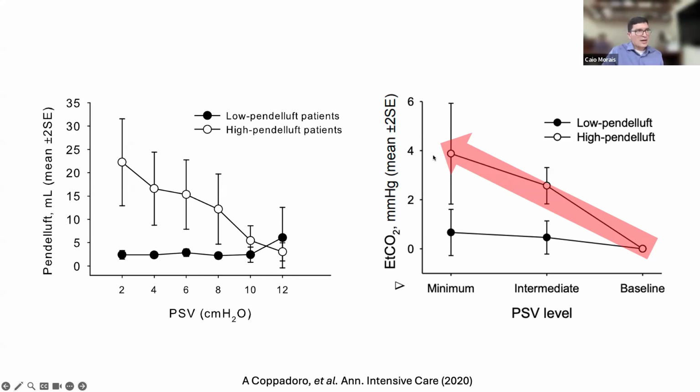And interestingly, the authors of this study found that patients with high pendelluft presented high end expiratory CO2.